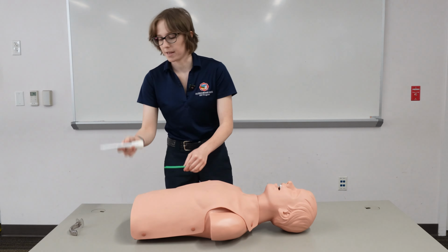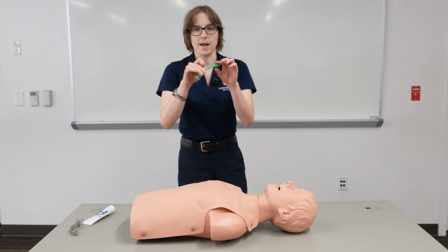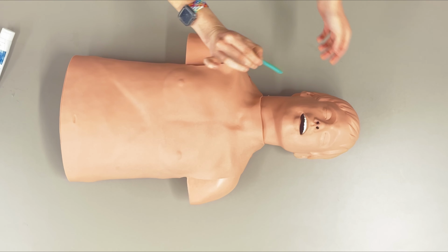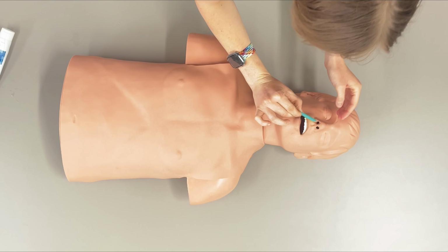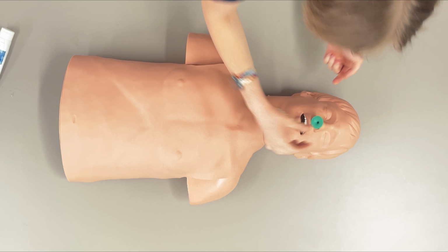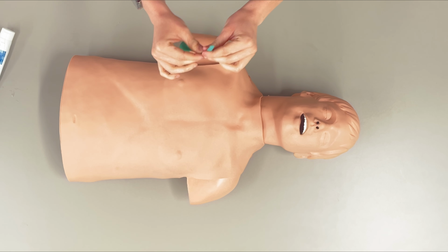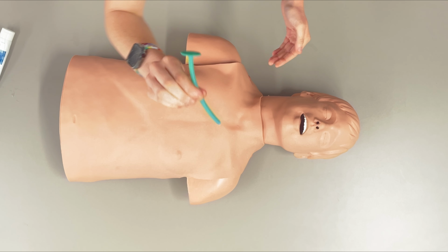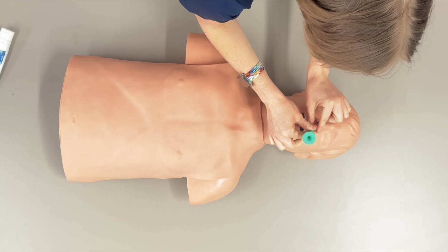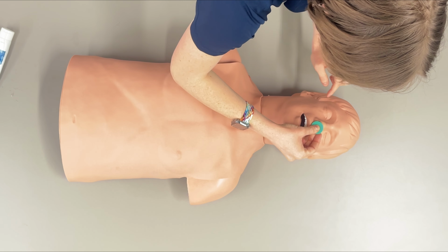Next, I'm going to grab my lubricating jelly and lube the NPA before I insert it. I'm going to insert this NPA with the bevel towards the septum. In the patient's right nostril, it will just slide right in, like so. If you need to apply this NPA to the patient's left nostril, you're going to also insert it with the bevel towards the septum, but you will have to rotate it, just like the OPA, kind of 180 degrees, like so.